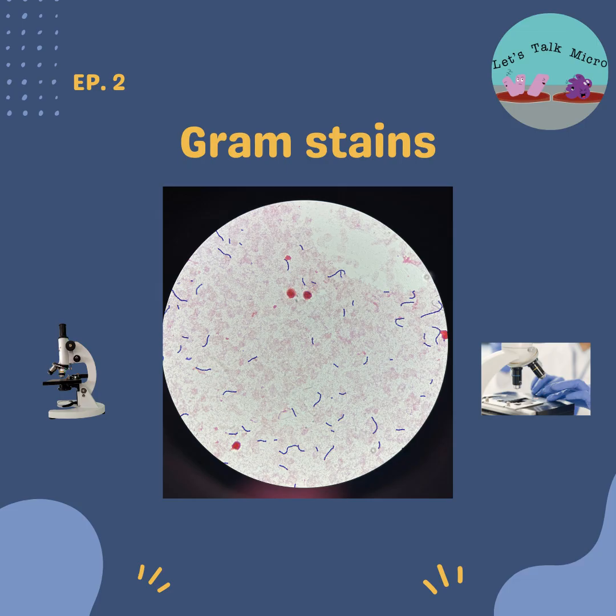This process is actually very helpful when you're doing blood cultures. Sometimes blood culture instruments might be very sensitive. When a bottle is flagged as positive, you take it out, you make the slide, and you might not see anything. Then you perform a cytospin on it, and then you might see. If the number of organisms is low, you are able to see it better with a cytospin slide.